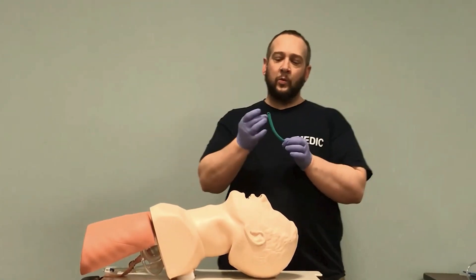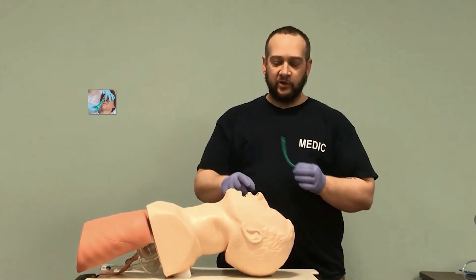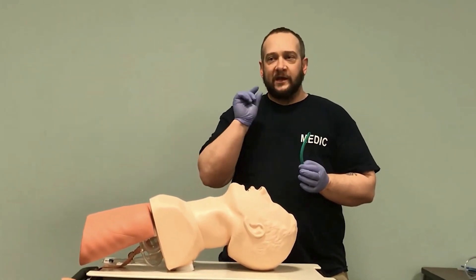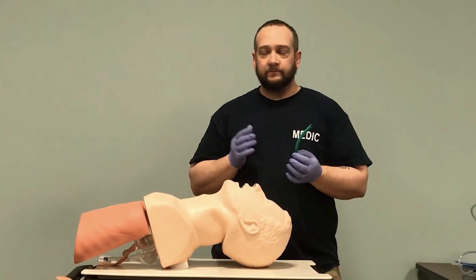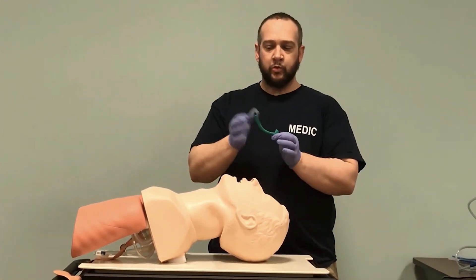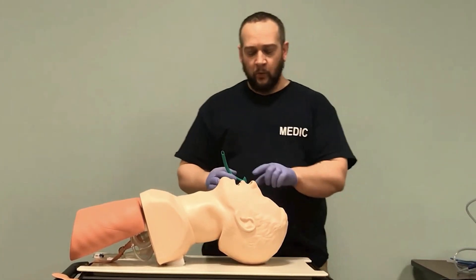When we look at how to insert this, we always want to have the bevel end towards the septum — towards the middle of the nose. In most of the population, the right naris is a little bit larger anatomically than the left. So these come pre-beveled to go into the right naris.